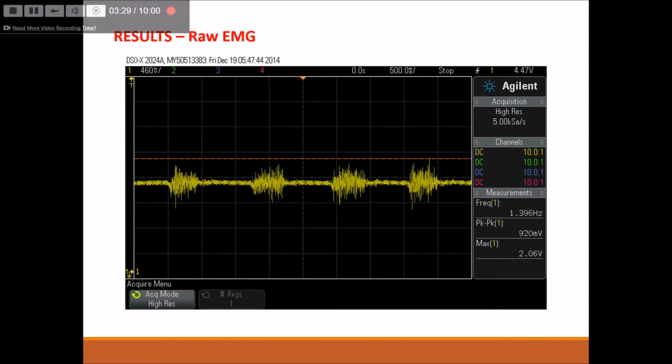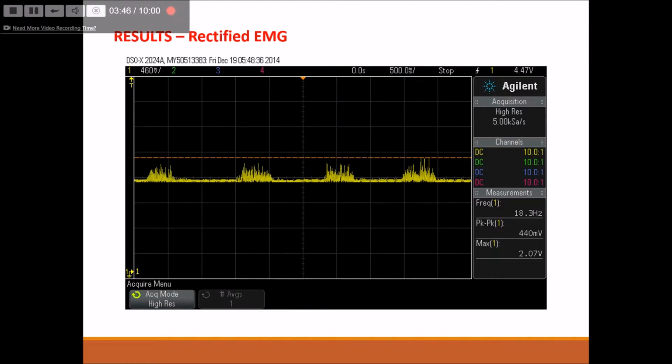Looking at some of the results of our EMG itself, we're going to go through a couple different oscilloscope screenshots. The screenshot you see right now is of the raw EMG signal after it comes out of the instrumentation amplifier. So it is not rectified, and you can see it is fairly noisy. Then we rectify the signal, so you can see that everything is positive in comparison to the COM.